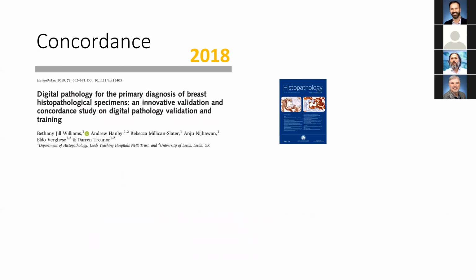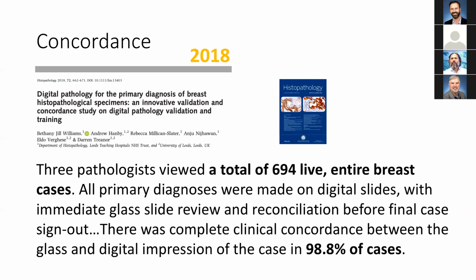There are a lot of studies that go on to whether there is a concordance between digital pathology and microscopes. I'm just showing one of them. Many papers have been published in that regard that show that the end result of light microscopy diagnosis and digital pathology are basically the same. So there is fundamentally no concern anymore in that regard.